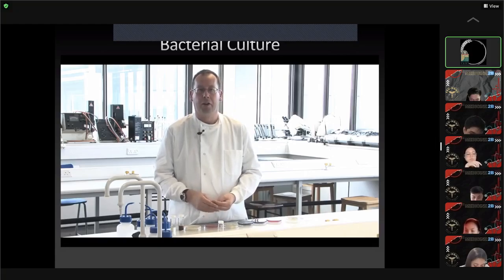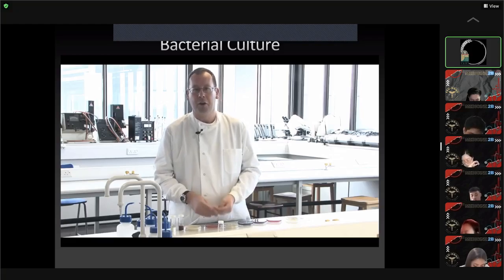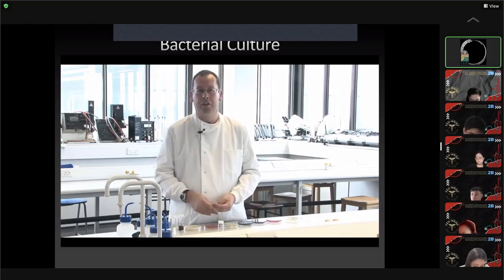If that microorganism is present, it will utilise the modified substrate as it grows. Therefore, the modified substrate will be hydrolyzed, releasing the chromogen and producing a coloured colony. And so the specific colour of the colony is an indication as to the identity of the microorganism.